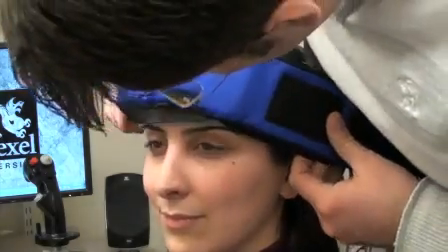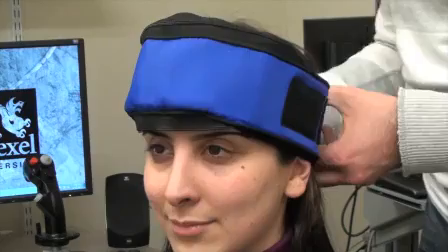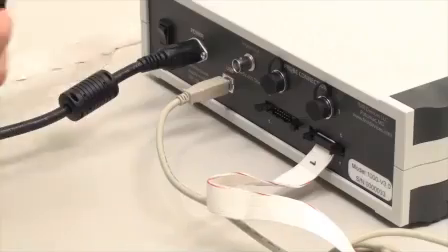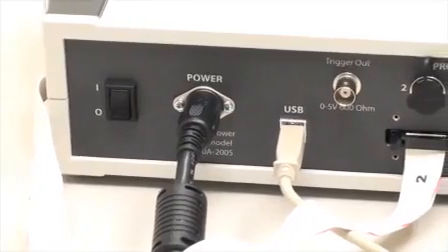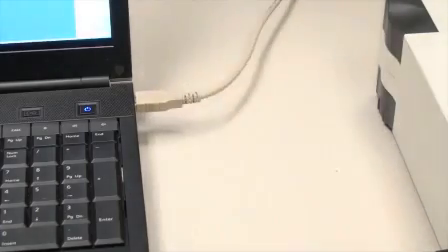Sometimes a headband, elastic and/or firm cloth, such as a tennis band or bandana, can be placed over the fNIR sensor to secure coupling of the optodes with the skin. After the sensor is positioned, signals at all channels should be verified by starting data acquisition. First, the sensor pad should be connected to the fNIR hardware control box. The device should be connected to the computer by a USB cable, and both systems should be powered on.